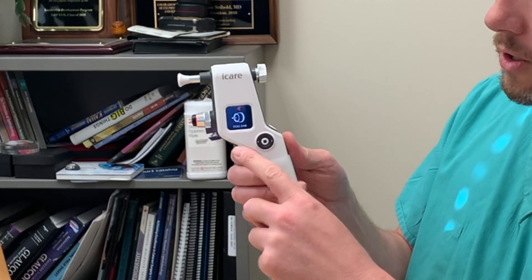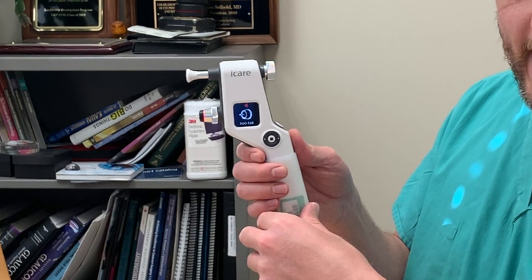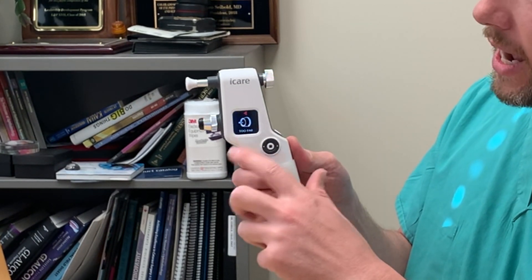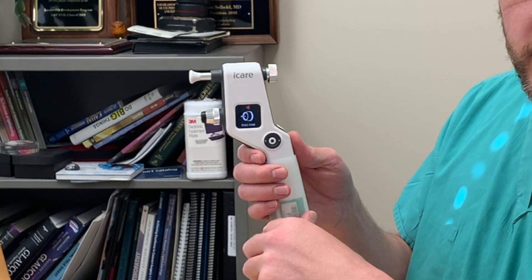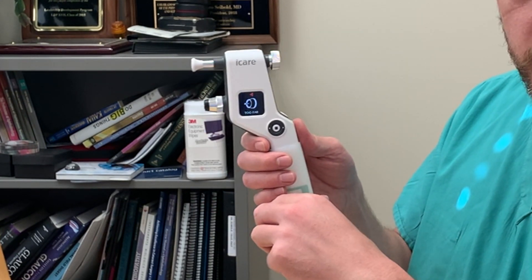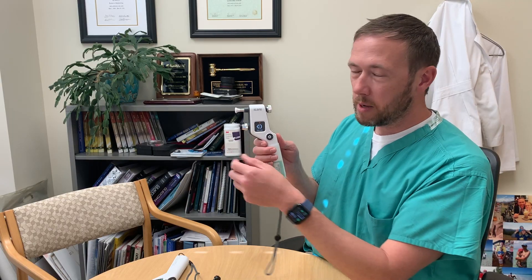A couple of error readings to note: if you're too far away from the eye, it'll give you a short, quick double beep and say 'too far.' Or likewise, if you're too close, it'll give you the same warning beep and say 'too near.' You'll then need to adjust your position. You want the probe to be about four to eight millimeters away from the cornea to get an accurate reading.